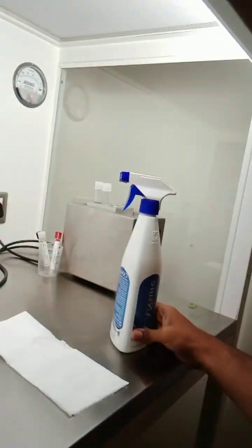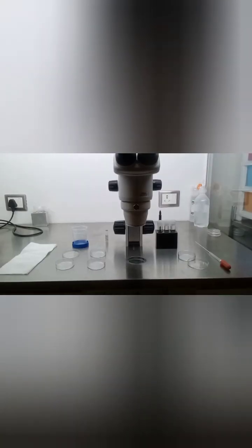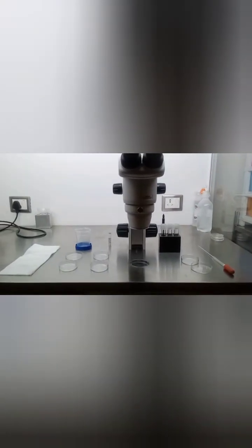Day 0, or the day of oocyte retrieval. 20 minutes prior to the OPU, we switch on the heater for the stage and we clean the LAF using HPLC water or OOSAFE. Following that, I keep HYASE and PVP outside the refrigerator and prepare the LAF for screening process to begin. I keep few dishes for screening. I open a container and use that for pouring the excess follicular fluid. I keep a dish to pour the flushing media with oil overlay.